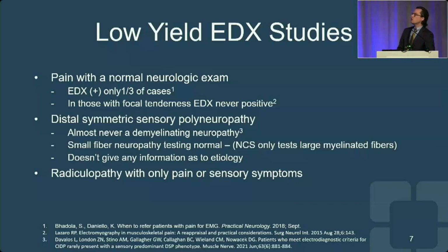In patients who have distal symmetric polyneuropathy, so that's a diabetic patient who has burning pain in their feet and some distal sensory loss, I don't actually think electrodiagnostic testing is very helpful. It may be abnormal. In many cases, it's normal because most of those distal symmetric polyneuropathies start off as small fiber predominant. Remember, on an EMG, we're really only testing large myelinated fibers. So if you have a process that's mainly affecting small sensory fibers, your EMG test is going to be normal.